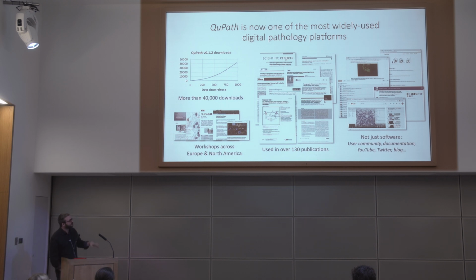So it's starting to become very widely used, particularly in pathology, but there's a lot more that it can or could do over the next year or two. There have also been some workshops in Europe and North America, but what I found through creating this is it's not really just about the software. There's also a user community, and the user community often do much more exciting things with it than I ever have, and think of new ways to apply it.